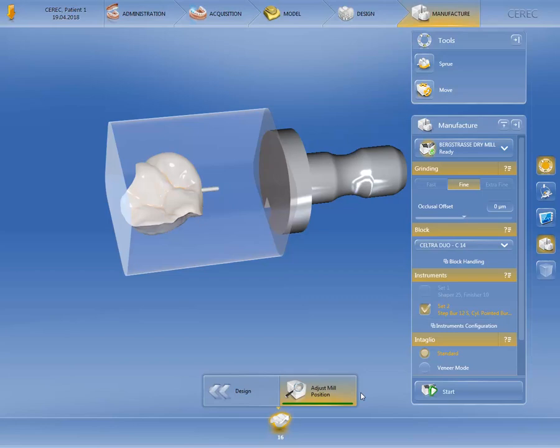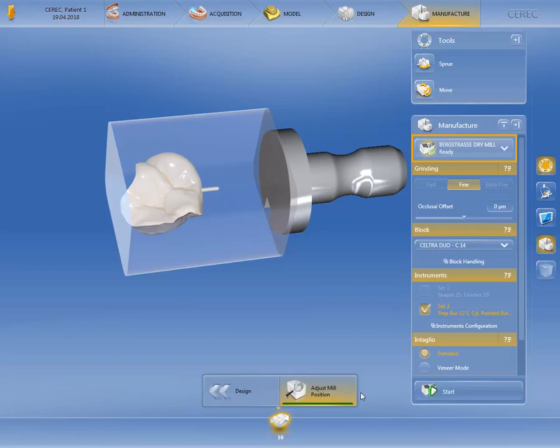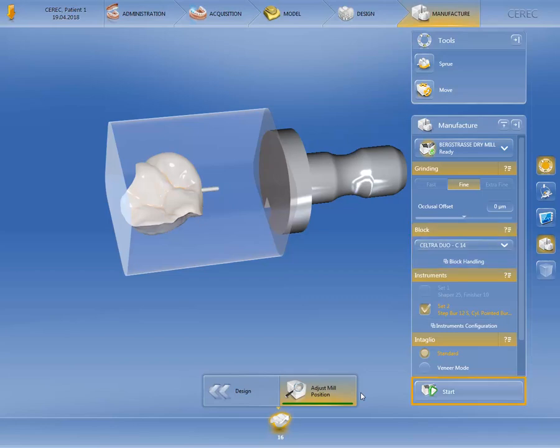The restoration is now automatically positioned in the block. Using the tools, you can correct the insertion point or position of the restoration in the block if necessary. In the window under Manufacture, you determine the milling and grinding unit to be used for the manufacturing process. You can switch between the grinding modes Fast, Fine and Extra Fine, depending on the materials selected. If required, you can also change the block size. Then you can start the manufacturing process so that the final restoration is manufactured after just 5 clicks.